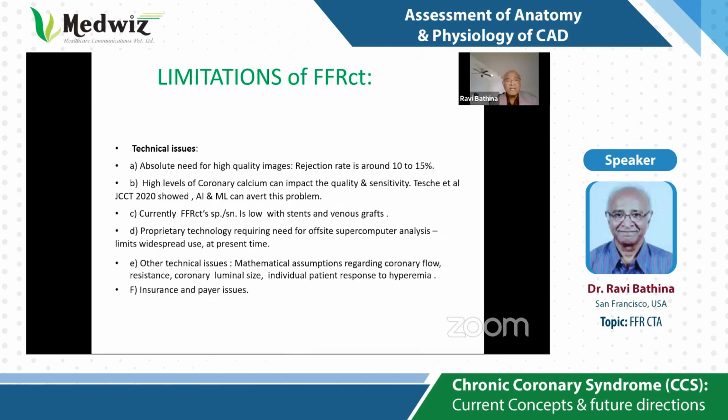So recently AI and ML are being brought into the picture, which will solve this problem of coronary calcium. Currently, FFR CT specificity and sensitivity is low with stents and venous grafts. And this is the bottleneck.